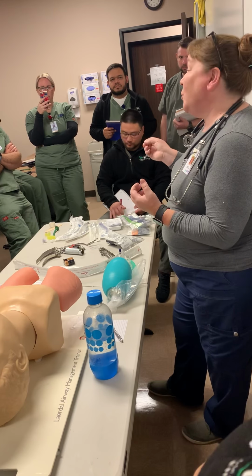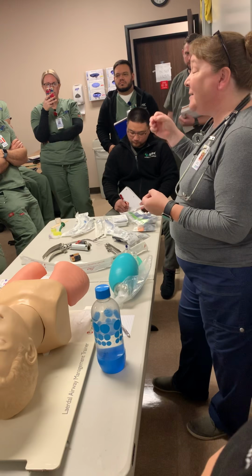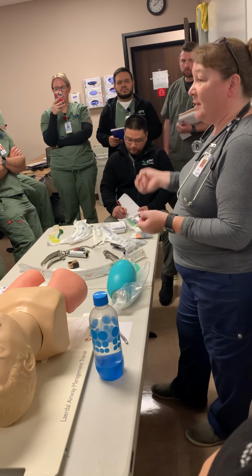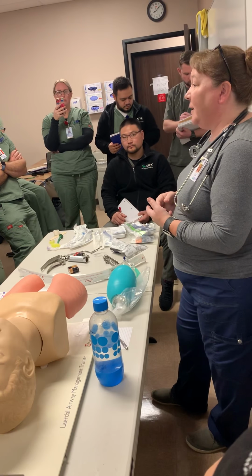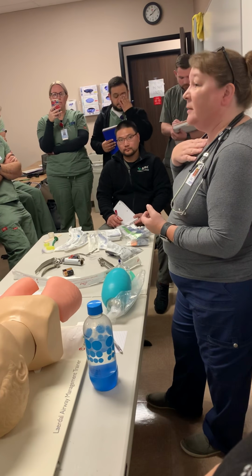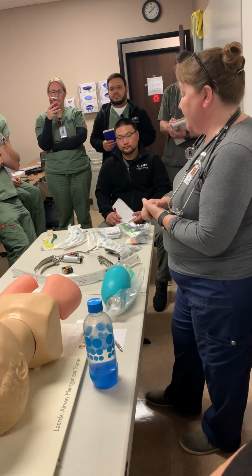It does come up on your boards sometimes, where you've intubated a patient, their ventilation is fine, their oxygenation is fine, but they couldn't protect their airway, so we had to go ahead and put the airway in. Likely to be an endotracheal tube, but it could also end up being an emergency crike or a trach, depending on the situation.